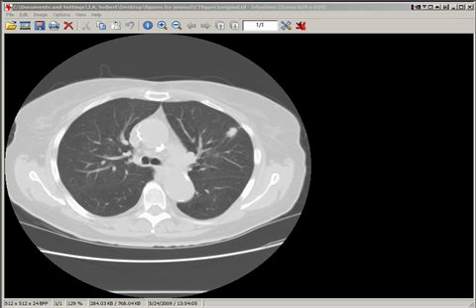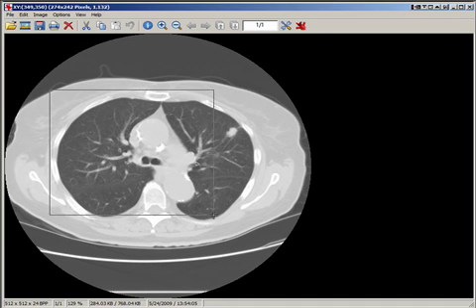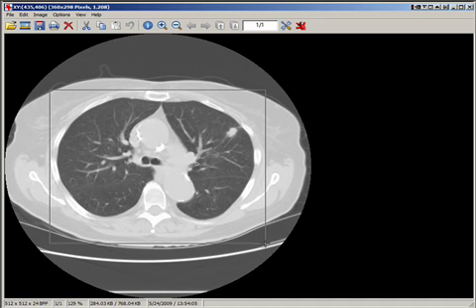Cropping the image, if necessary, can be performed using IrfanView by placing the mouse over the image, clicking the left mouse button, and dragging the rectangle over the important area of interest.